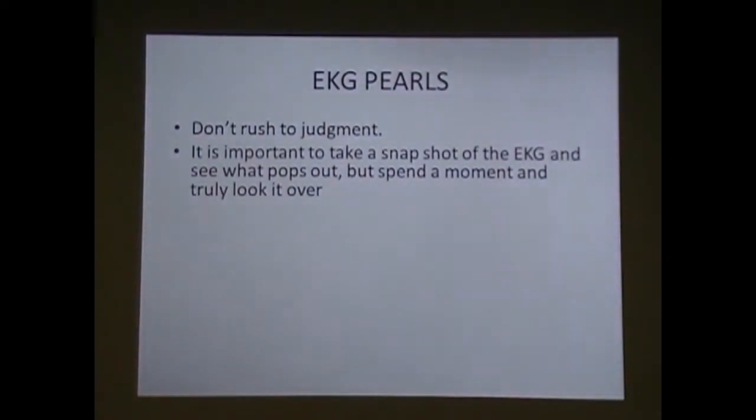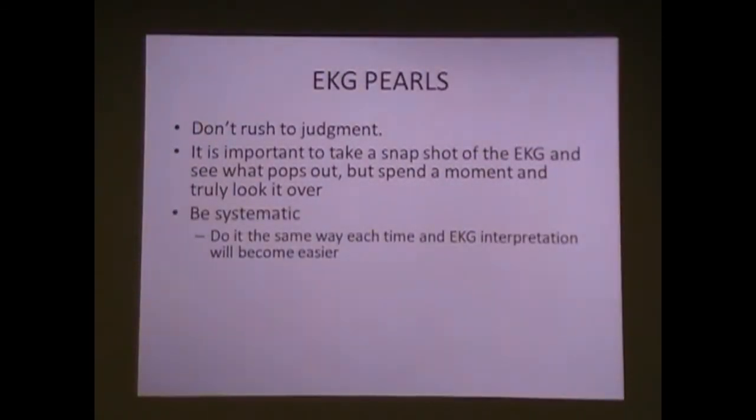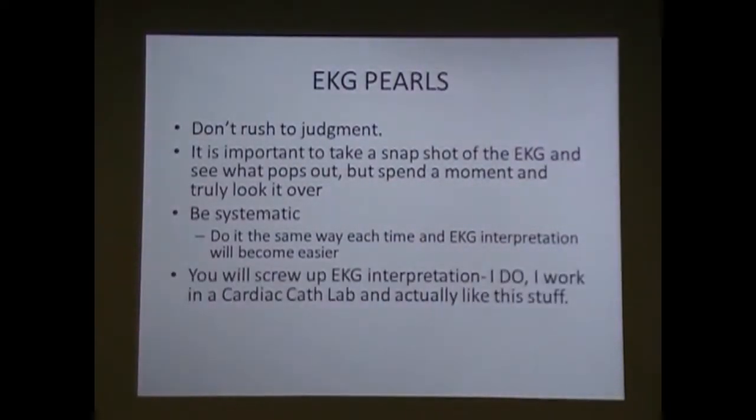It is important to take a snapshot, look at it really quickly, and see if there's something that pops up that needs immediate attention, but then spend a couple of moments looking to see if there's anything else going on. It's hugely important to be systematic. If you do it the same way each time, it's going to become easier and ingrained, and you're less likely to miss things.